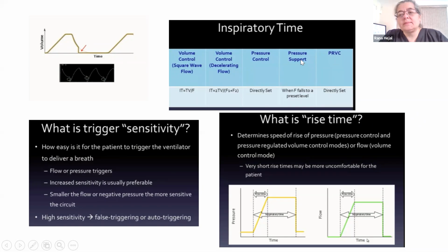And in pressure support, you have to set up something. Actually, the majority of times there's a default that the ventilator does. Remember, in pressure support, the patient is taking every single breath. They initiate it, and as they initiate it, they generate a flow of gas.